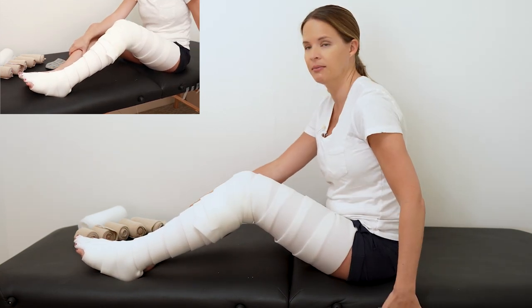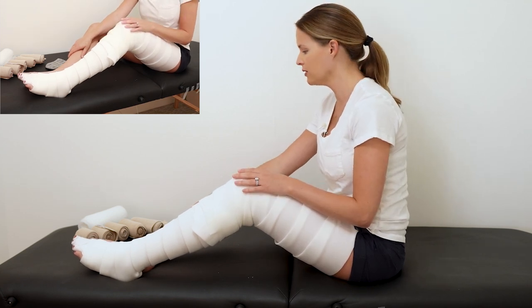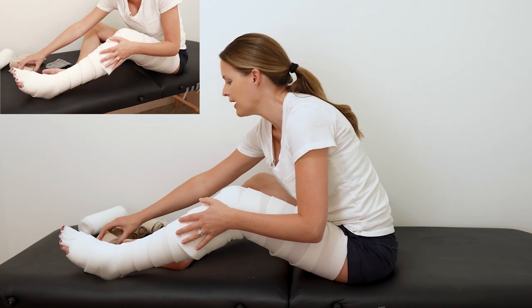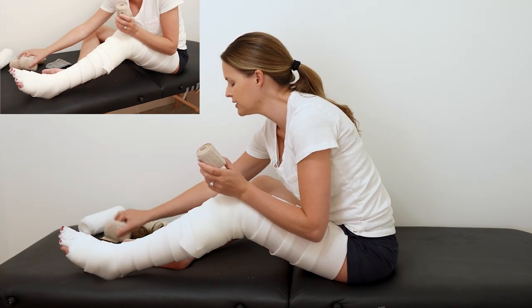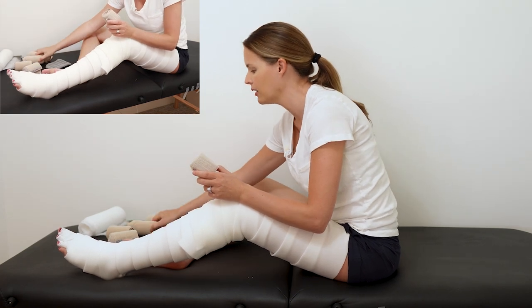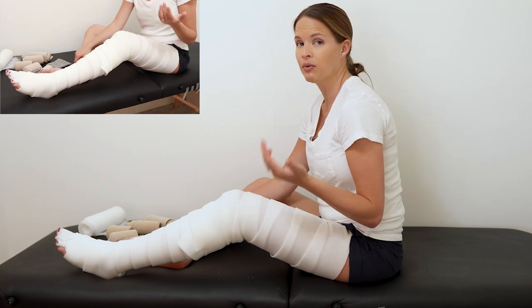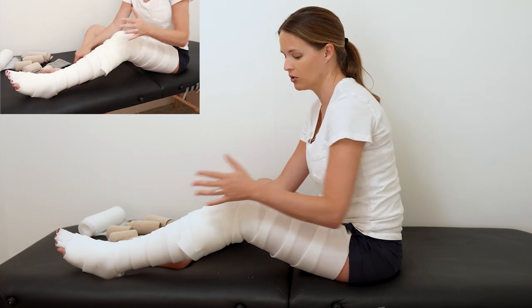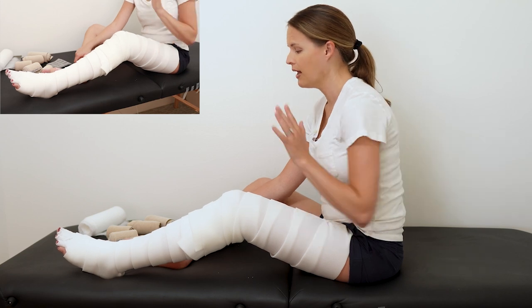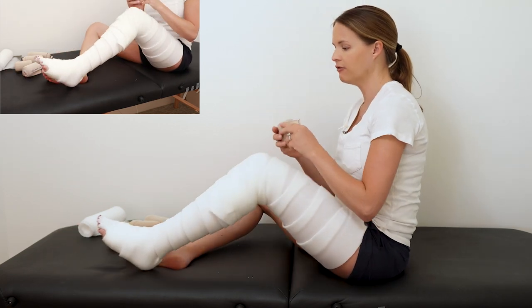Bandage-wise, I have a six centimeter for my foot, a couple of eights for my lower leg, and a ten and twelve for my upper. Some people will need more bandages, some might get away with one less. I'd recommend at least four total — two for the lower leg and two for the upper — but ideally five. I'm going to use the six centimeter for my foot.